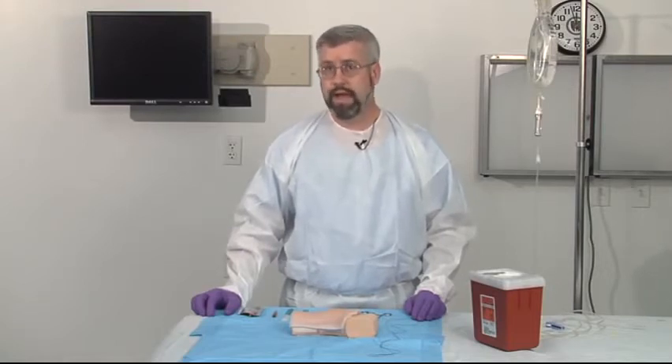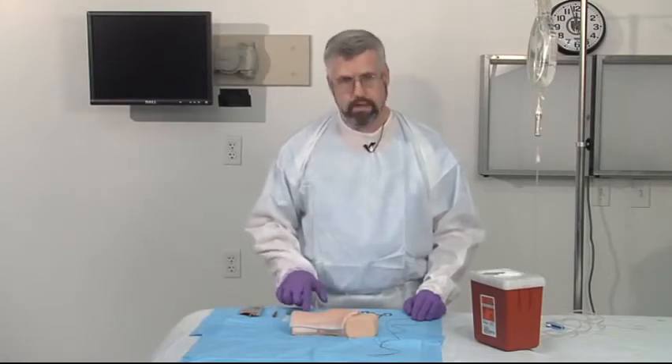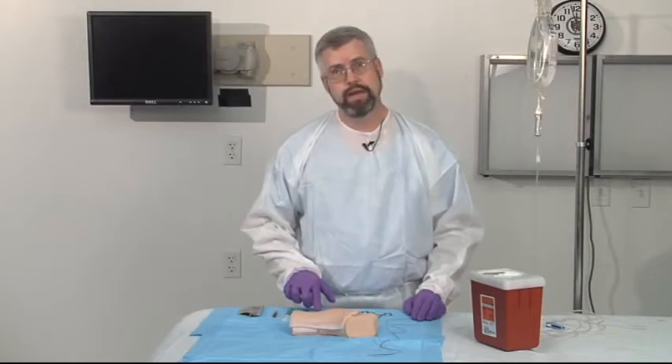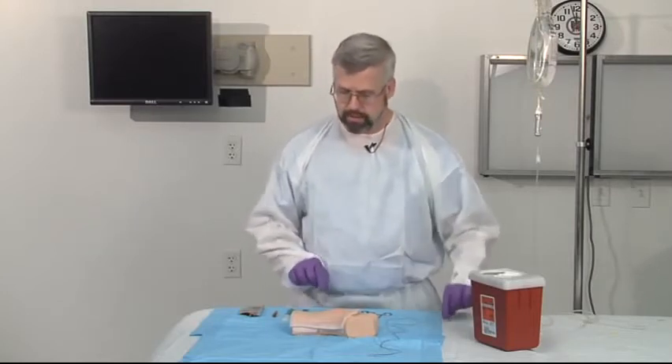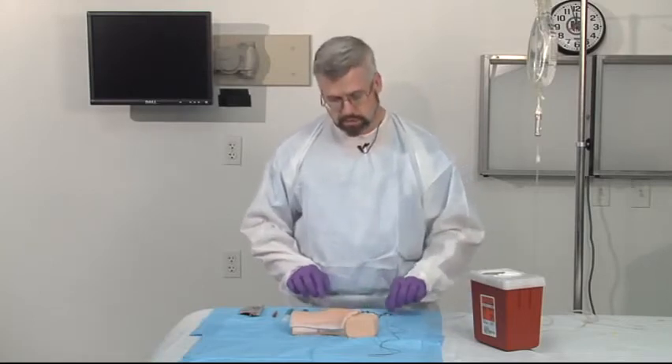There are several things that you want to make sure you have prior to doing a cut down. You want to make sure that you have the proper equipment. Things that you need at your disposal are a number 15 blade, a number 11 blade, you want an angiocath, or alternatively, you might actually use the end of an IV tubing to place within the vessel. You're going to need a pair of scissors, a couple of mosquito clamps, and some 2-0 silk.